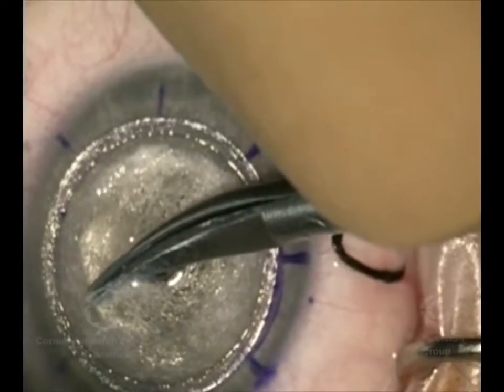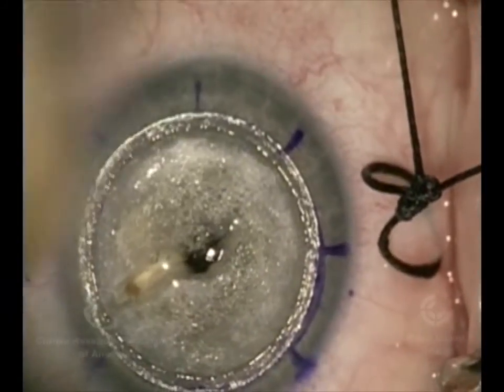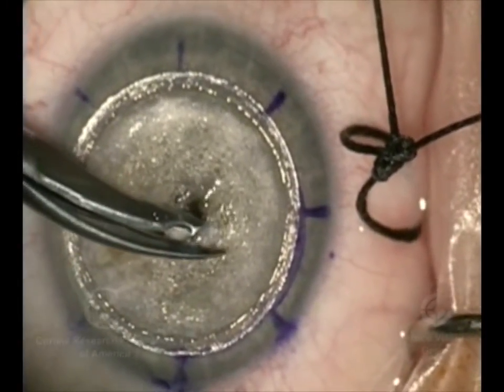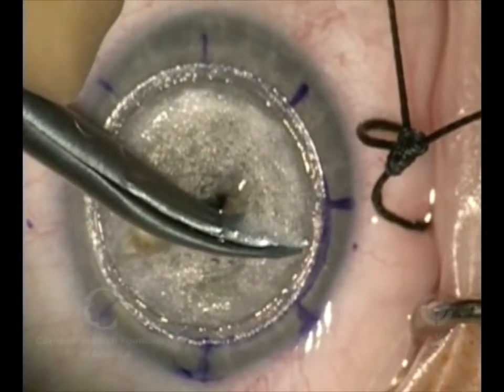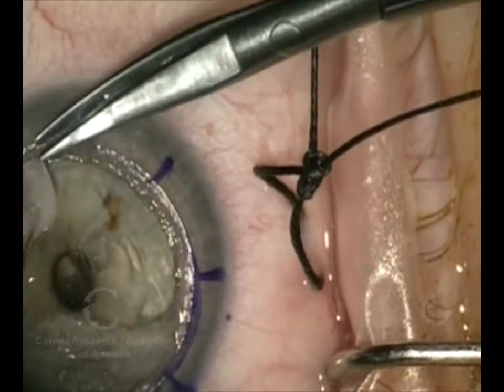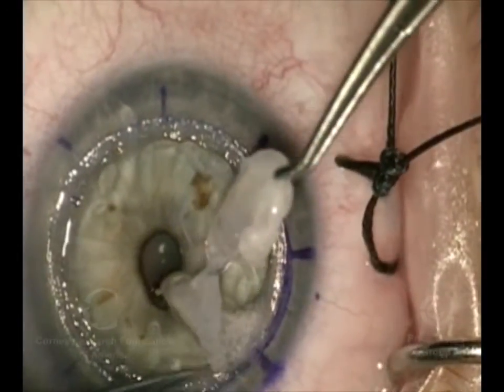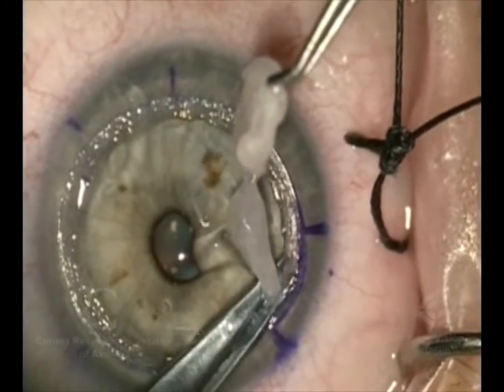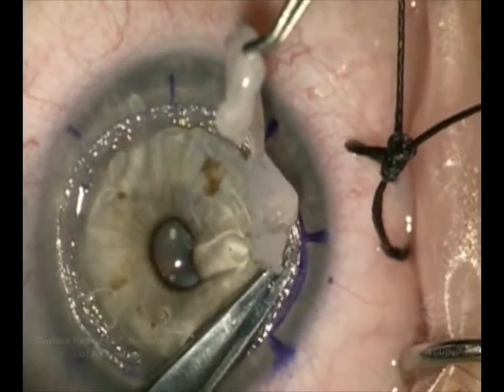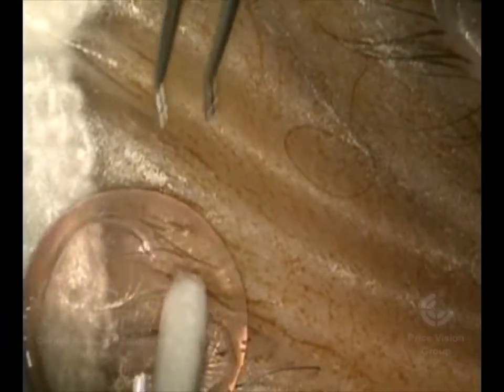Once we've made the incision, we're going to take our scissors and cut through this outer layer that we want to remove. The inner layer that we're keeping — that very thin membrane — is about 10 to 15 microns thick. We're going to leave that in place; it has the cells on the cornea that keep it clear. We're trimming off the outer layer called the stroma, leaving that thin membrane. You can see the edge of the cornea and the cut made with the femtosecond laser, which gave us a step or zigzag incision.